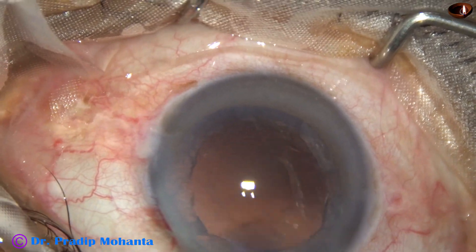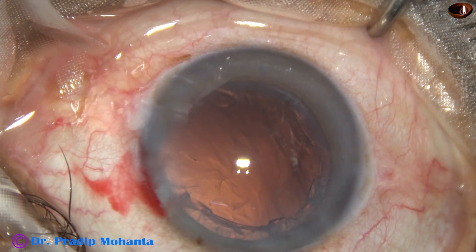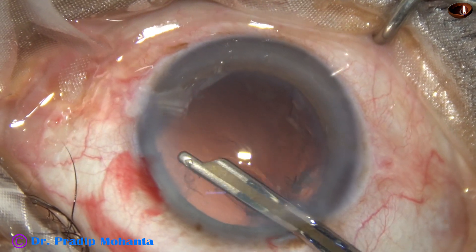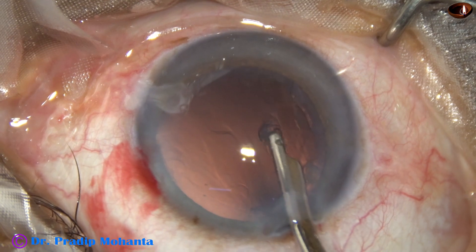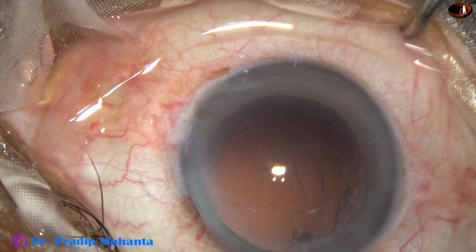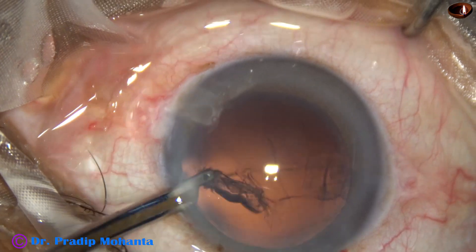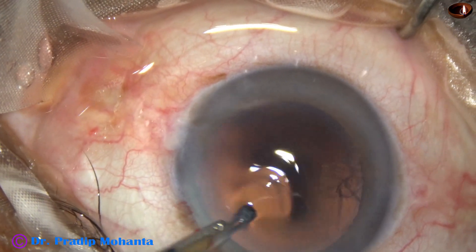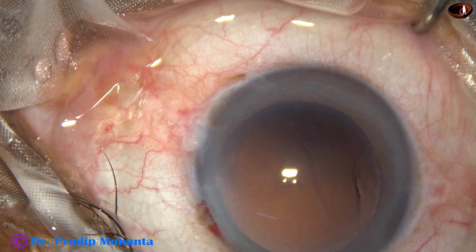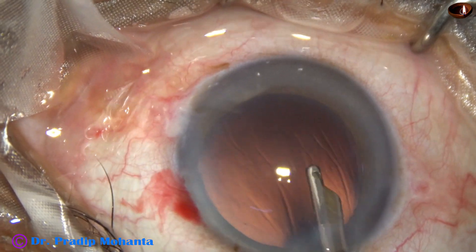The cortex is removed using a 23-gauge Simcoe cannula. We are having a fairly good red glow, which means the retina is attached. We had also done an ultrasound B-scan and confirmed that the retina is attached. This is the last bit of cortex, and it is removed. The posterior capsule appears clean.